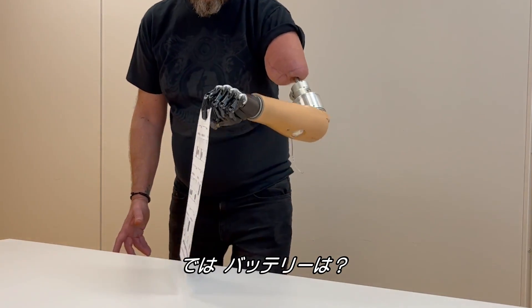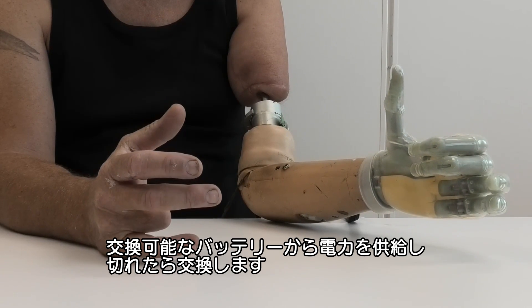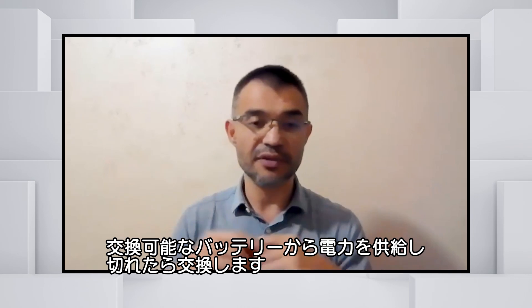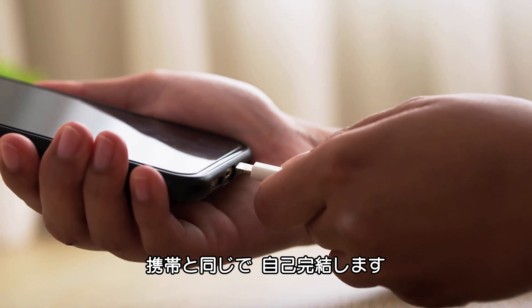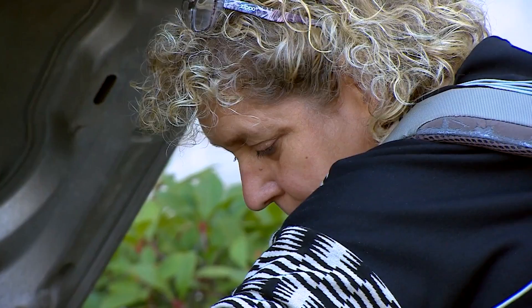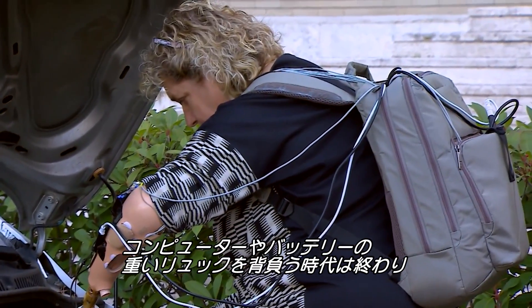This hand provides rough but useful sensations — a patient can feel when an object is in their hand and when it's slipping. As for batteries, the CPU and motors are powered by interchangeable batteries in the prosthesis that normally last a full day, much like a phone. Everything is self-contained, so the days of patients carrying heavy backpacks full of computers or bulky batteries are gone.